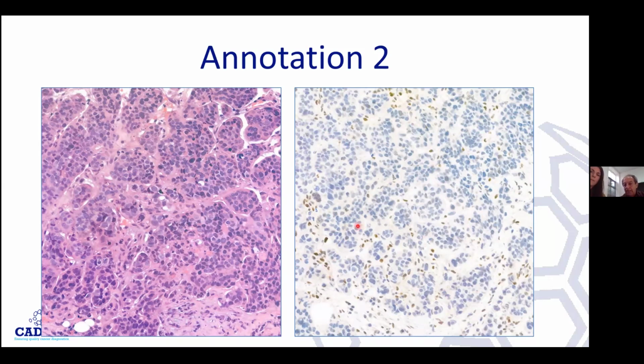Looking at these pictures you're showing us, one improvement I would ask our laboratory to do is go easy on the counterstaining. I'm just saying, that could be an improvement. To be fair, I prefer these ones, because you are telling us any amount of nuclear staining is important. So it's wonderful because then I can see. I don't want to be in a position where I look at it and say, well, I'm not sure whether this is counterstaining or real staining.